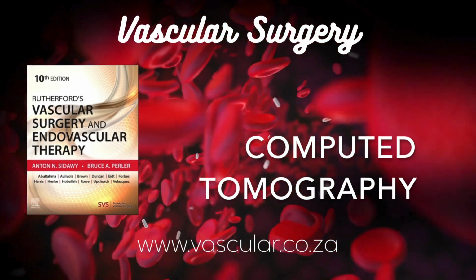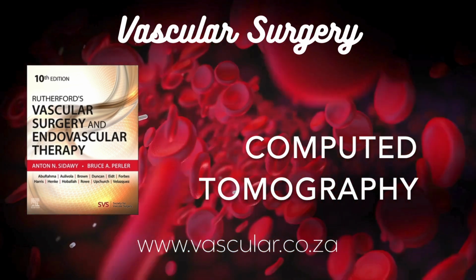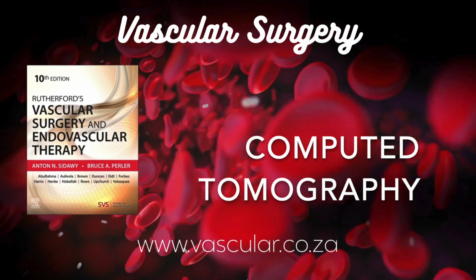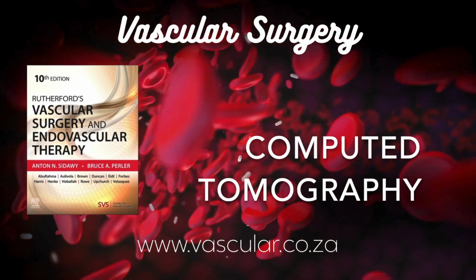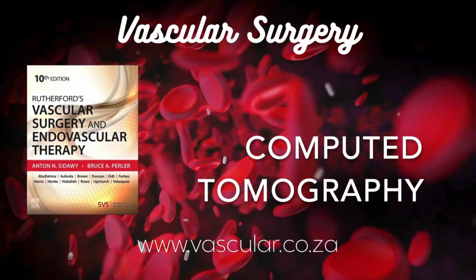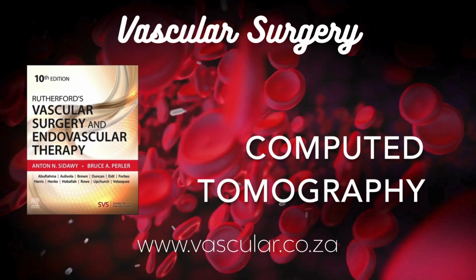In that fraction of a second, they can acquire data from multiple thin slices simultaneously or cover one large volume very quickly. It drastically reduced scan times again and allowed for imaging of much larger areas of the body in a single breath hold. Which must have basically killed off motion artifacts for most things. Pretty much, yeah. It dramatically reduced artifacts and just improved image quality overall. That's why multi-detector scanners have almost completely replaced the older single-row spiral systems.